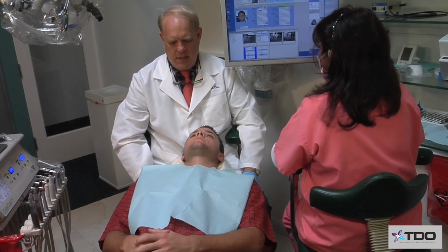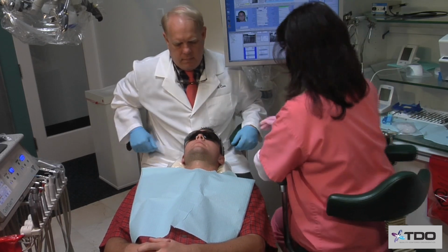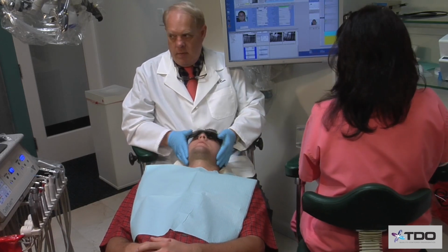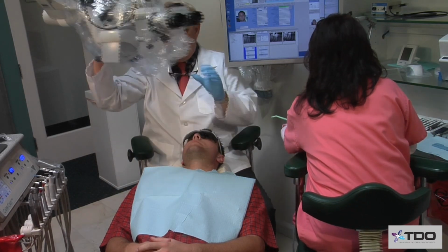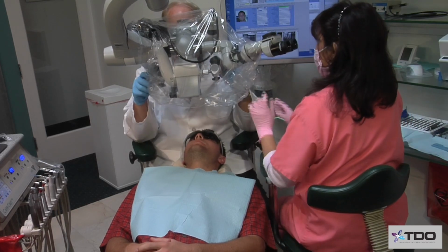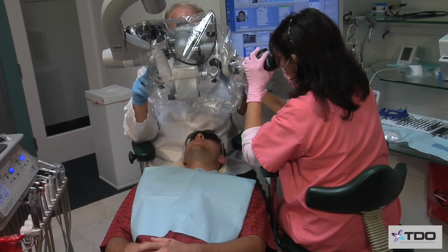do, the patient is in the Trendelenburg position, the doctor is at the 11 or 12 o'clock position, and the microscope is in a vertical orientation and not in any way angled or obliquely turned. The videos you see on this DVD have been shot over a 20-year period in our office, and in that entire 20-year period, we have always worked this way.